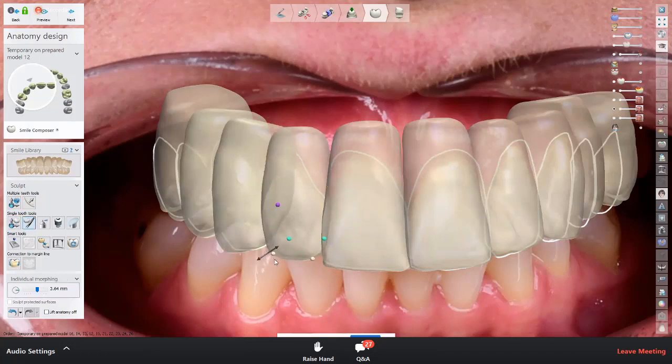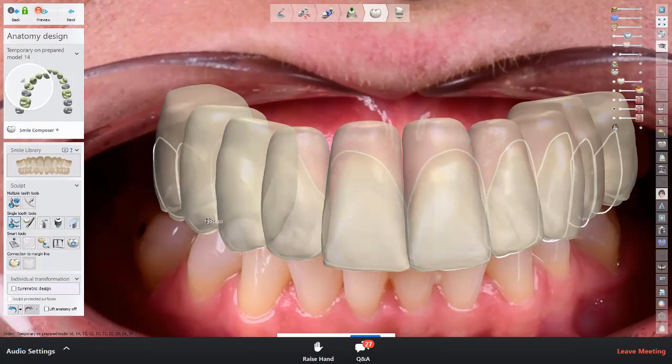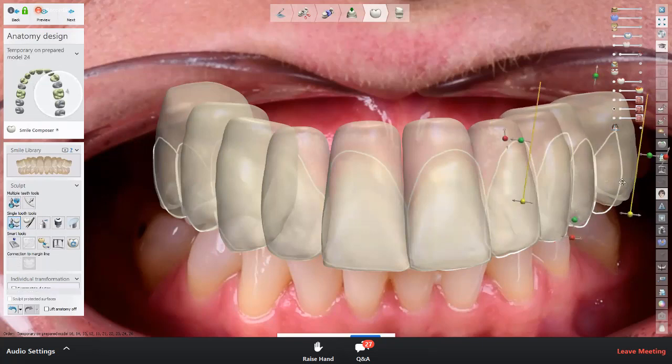I tried it actually a lot, and I'm working much faster with a regular mouse and the shortcuts on the keyboard and the mouse itself, because I have 11 buttons on the mouse. So after a while, you get used to where all the short commands are, and then you don't even think about what you're doing. And all the designers in my lab have the same short commands. So if we switch computers, we are always able to work quite easily on each other's computers, because if we had different short commands on the mouses, it would be crazy.